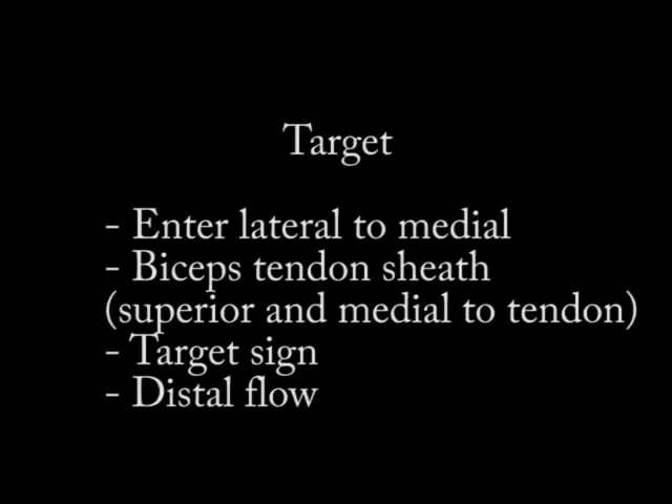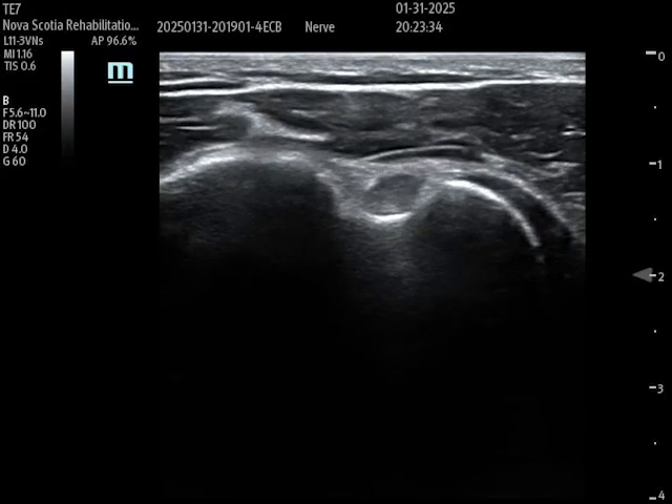For the target, I'm going in-plane from lateral to medial, injecting into the biceps tendon sheath — not in the tendon directly. I guide the needle superior and medial to the tendon, medial so that I'm avoiding the artery that runs laterally. When I inject, I expect a target sign: fluid filling around the tendon creating a target sign, and that fluid should spread distally along the tendon.